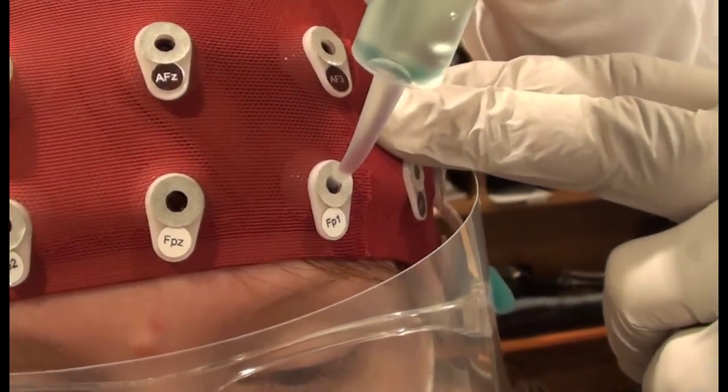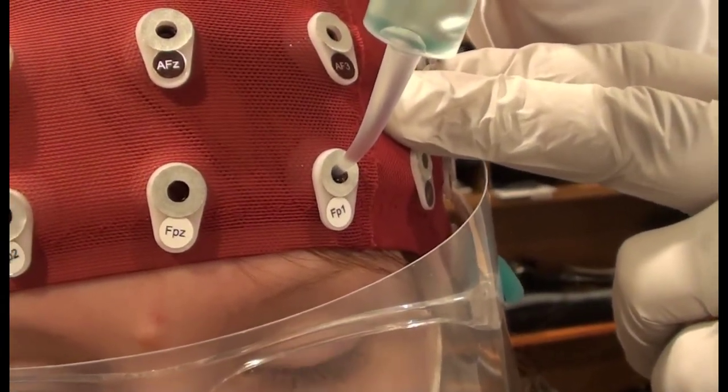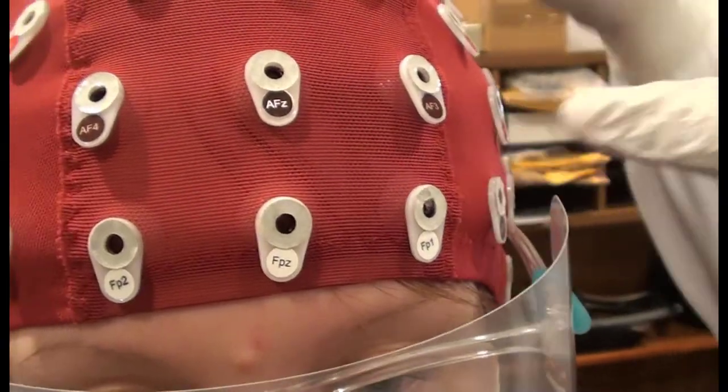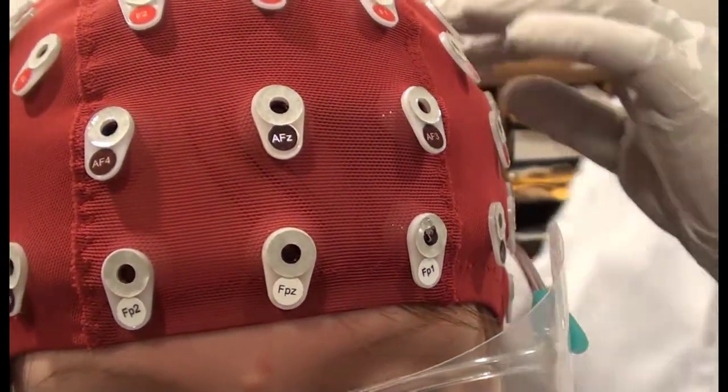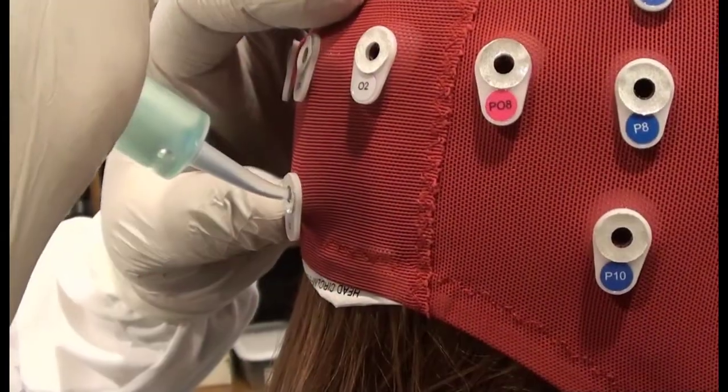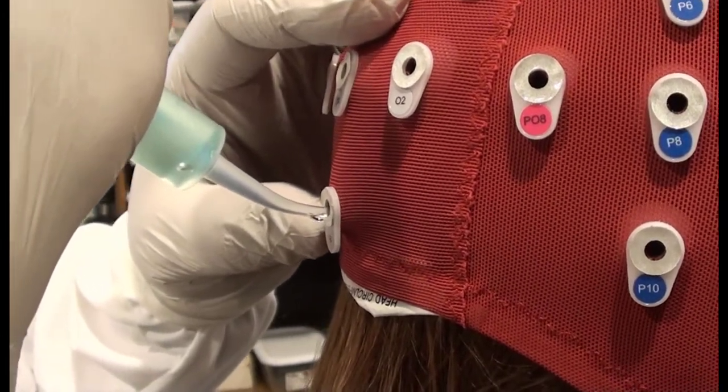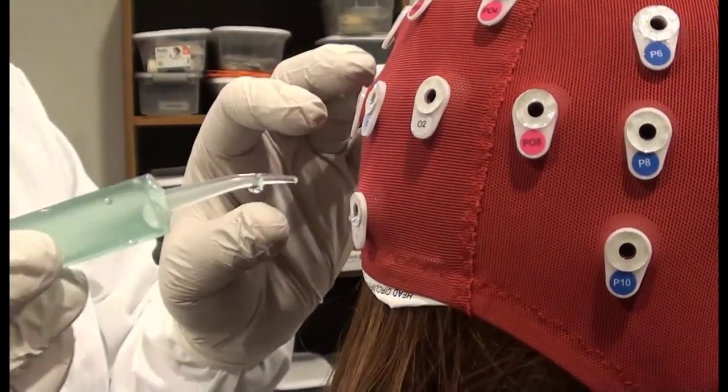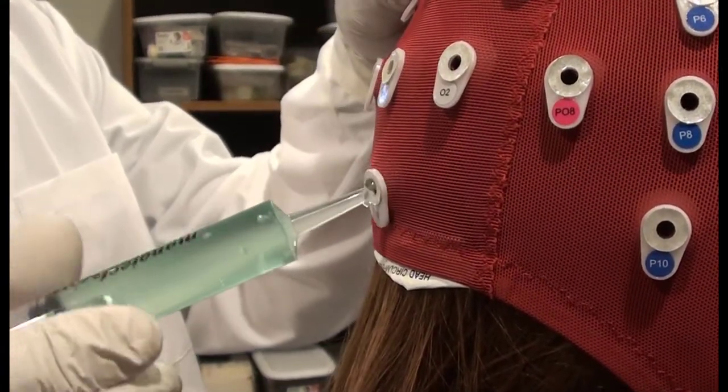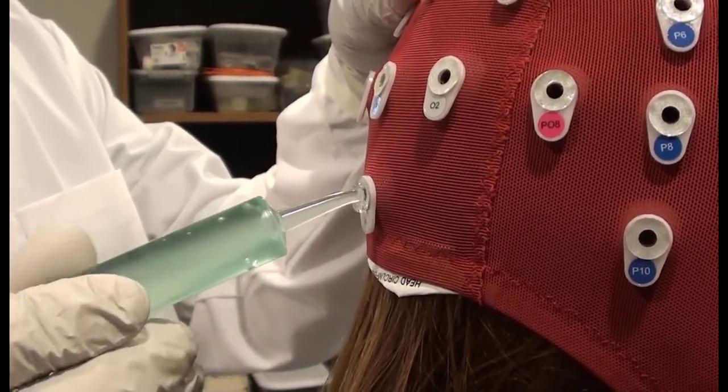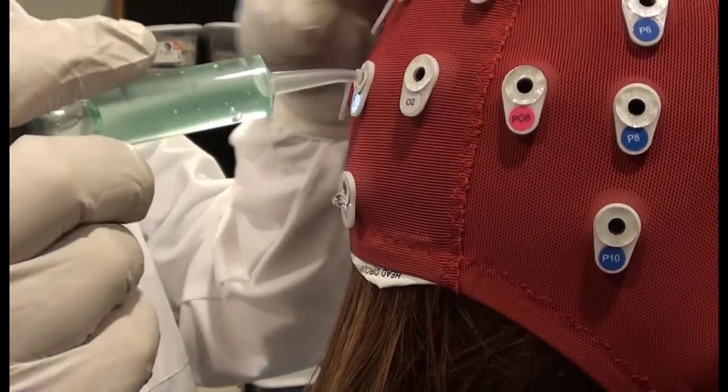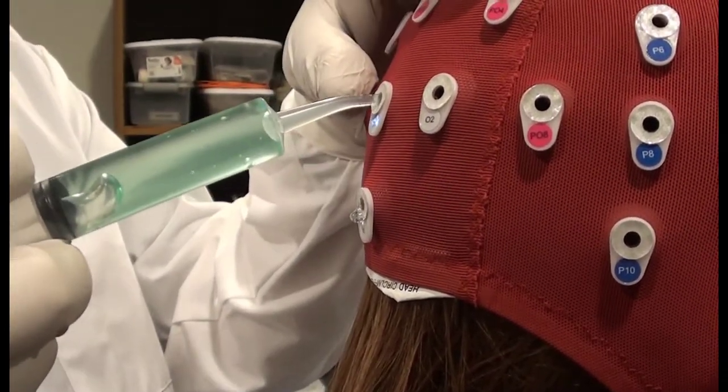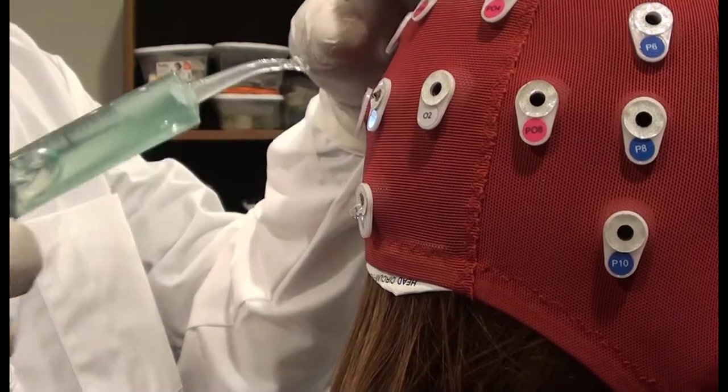Applying gel to the cap requires some technique and developing technique requires practice. Don't expect to do this perfectly the first time. I recommend starting by applying gel at a frontal site where the participant will feel it. Insert the syringe tip almost to the scalp and inject enough gel that you can see it squirt back out of the holder. Ask them if they felt the gel on their skin. If they say no, try again. If they say yes, move to a location at the back of the cap where you believe their hair is thickest.